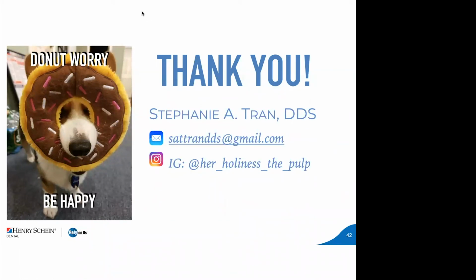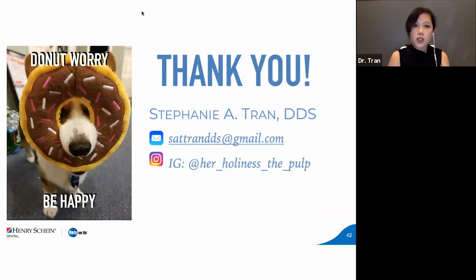Thank you, Dr. Tran. We've got time for a couple of questions. First one is, when you obturate, are you using master cones and accessory cones, heated obturators, or something else? I'm generally using master cones and not the heated obturators, but the down pack heat tips. Instead of the old school Bunsen burner, the heat tips, either cordless or corded ones, transfer heat into the gutta percha. In general, you're using a master cone, so we're talking about the more modern techniques of the laser measured gutta percha cones that match the files, so they will be a very close fit.